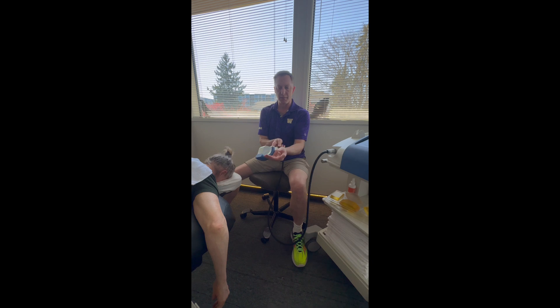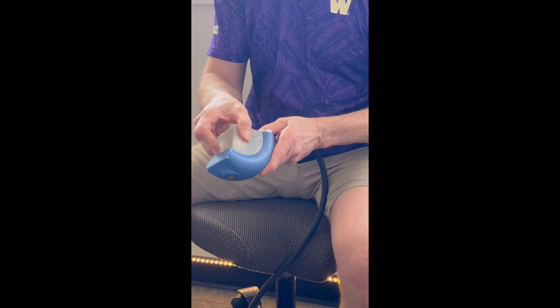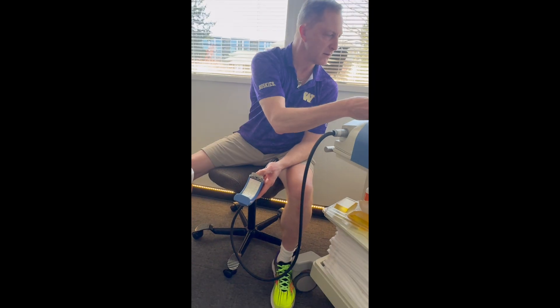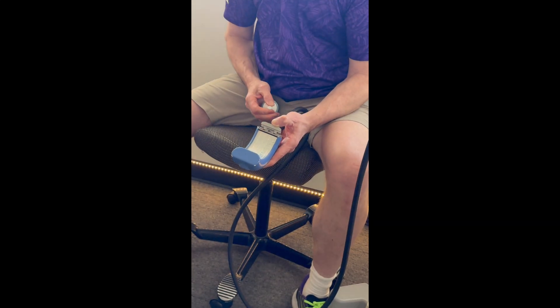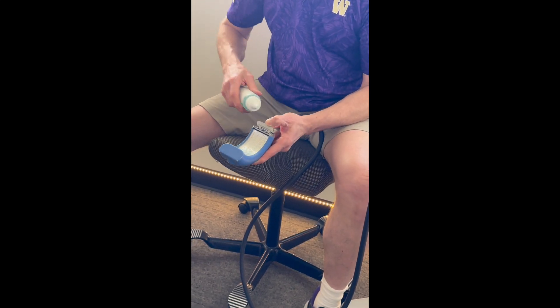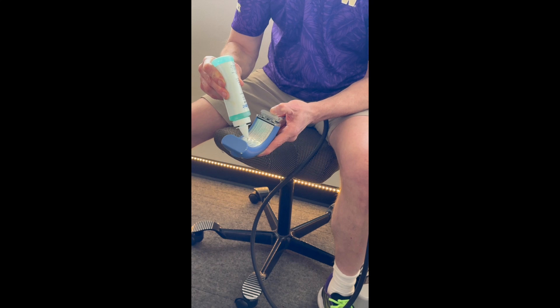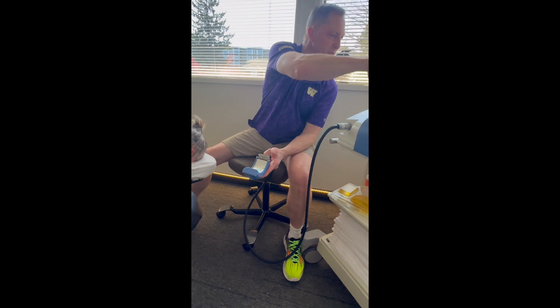You can see there's a crescent shape to this. We use these gel pads — I'll take one apart. You can see we've sprayed ultrasound gel in between here. I'll put a little more on to make sure we have a good connection, because we want that sound wave to go into the gel pad. We need plenty of connection lubrication to ensure the most sound transmission. Then I'm going to put some on the patient as well.